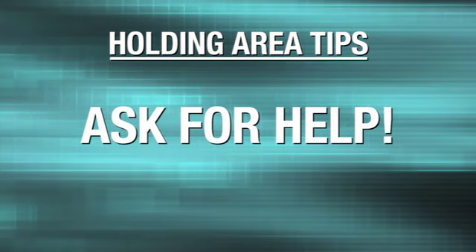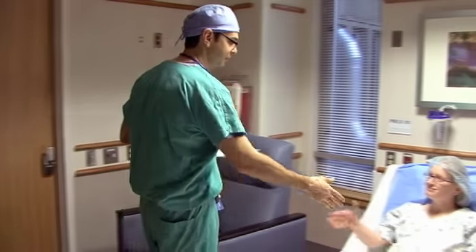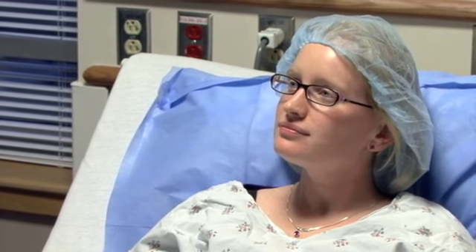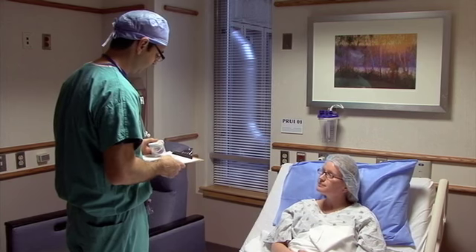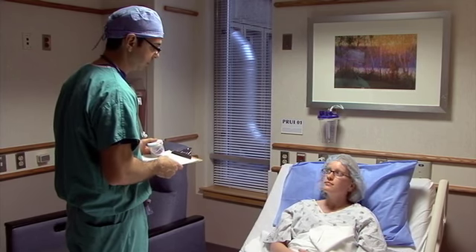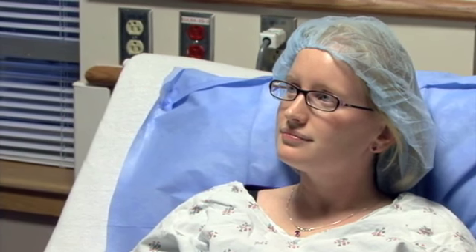Let's take a look at an example of a consent and assessment. Hi, Ms. Blue. I'm Dr. Isaacson. How are you doing today? Good. I wanted to talk to you a little bit about the procedure that we have planned for you today. Okay. Today you're going to have a portacath placed. Has anyone talked to you about that before? No. Okay. So this is a portacath. This is the port. It'll sit just under your skin in a pocket that we'll make up here in your chest.